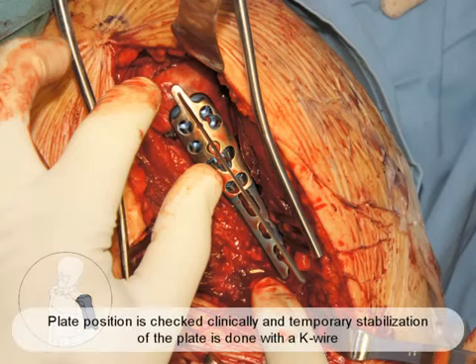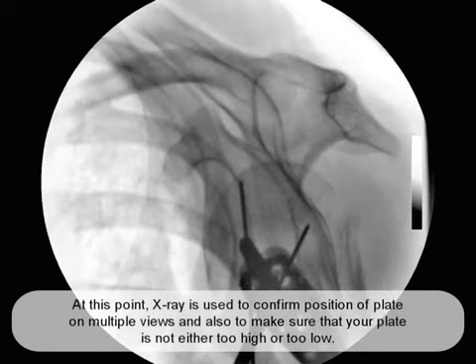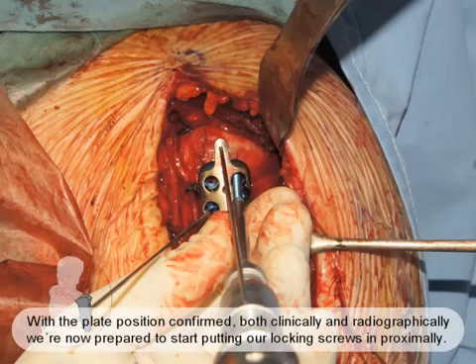Plate position is checked clinically, and temporary stabilization of the plate is done with a K-wire. At this point, X-ray is used to confirm position of the plate on multiple views, and also to make sure that your plate is not either too high or too low. So with the plate position confirmed, both clinically and radiographically, we're now prepared to start putting our locking screws in proximally.